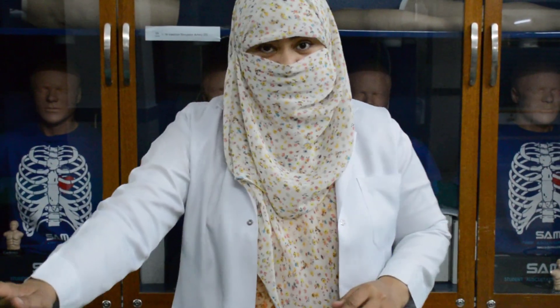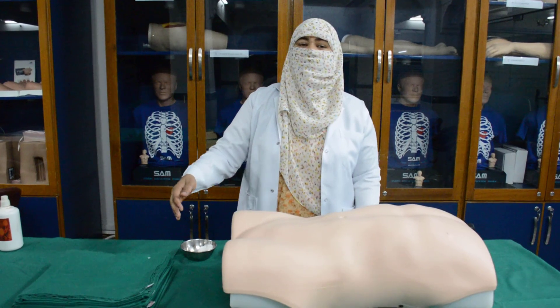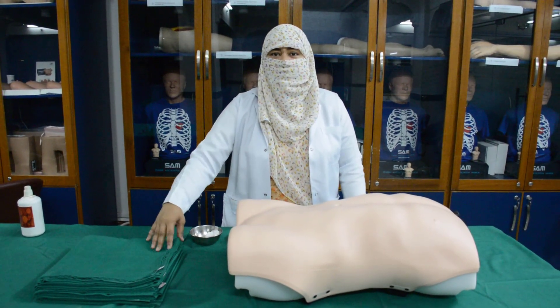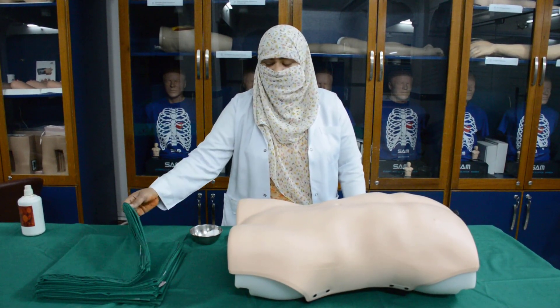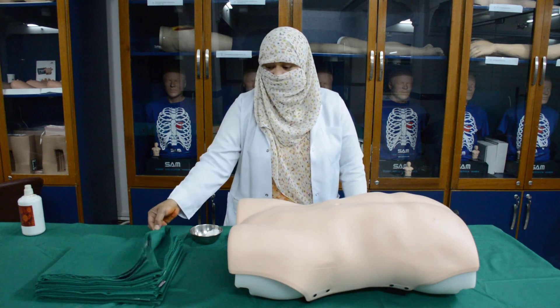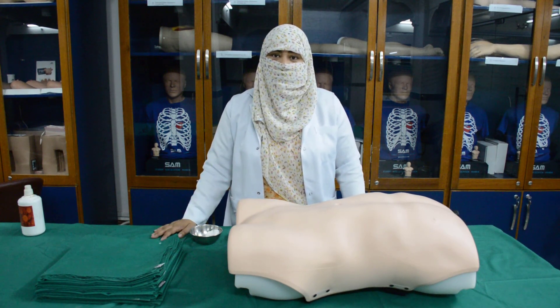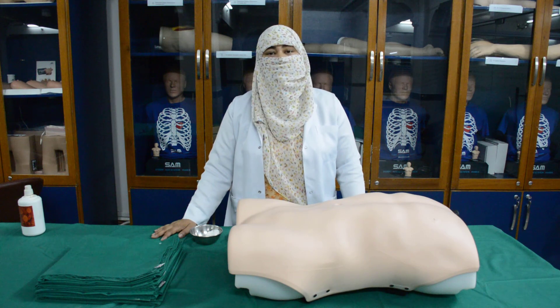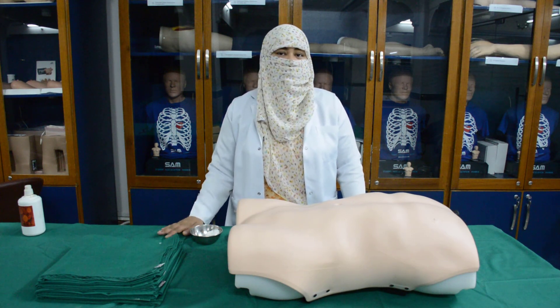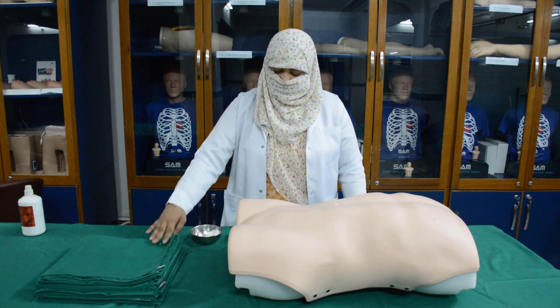These are the towels we are using. For draping the patient there are two ways: one uses these cloth towels, but now disposable drapes are also available. Here we will learn how to drape the patient with these cloth towels.